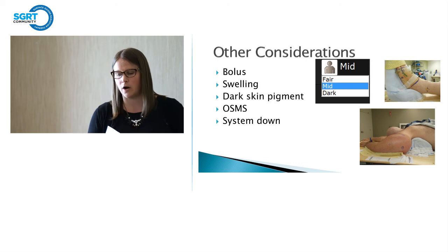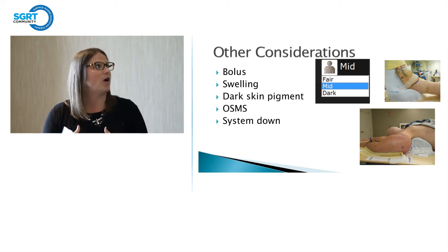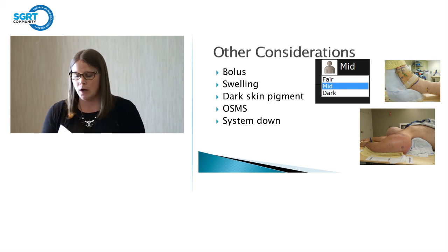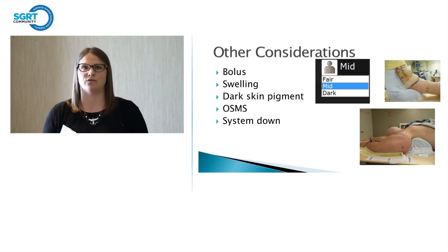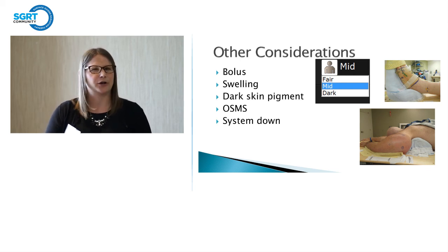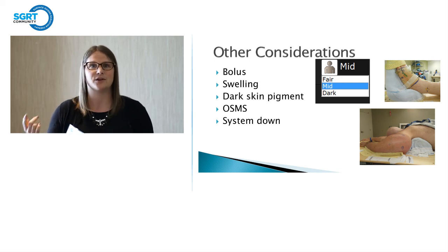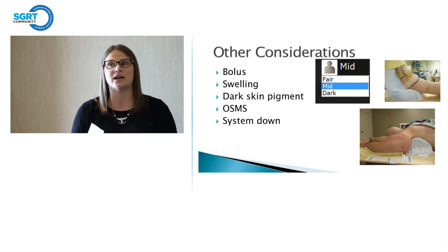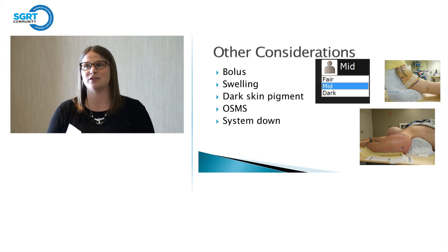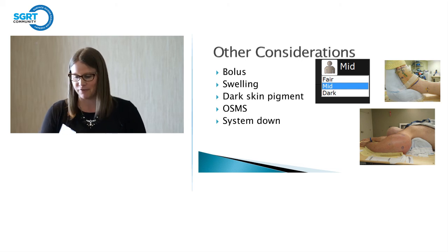Other considerations are for patients with dark skin pigmentation. So Vision defaults to that mid-tone. I didn't even realize that was an option until recently. We had a very dark skinned patient, and it was just really hard to see. The surface just wasn't capturing a good image. So we called our physicist, and he came down and was like, did you try the dark skin tone? Light dawned on Marblehead. We didn't even know that was an option. And it's wonderful, and it's actually great because it's so hard to see that patient's tattoos too, that it's a nice sanity check that we are exactly where we need to be every day.